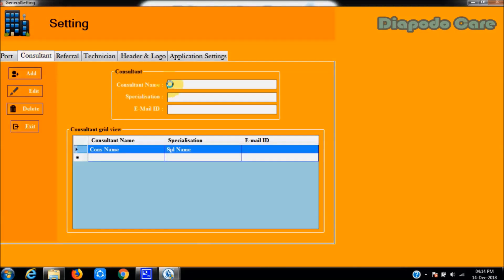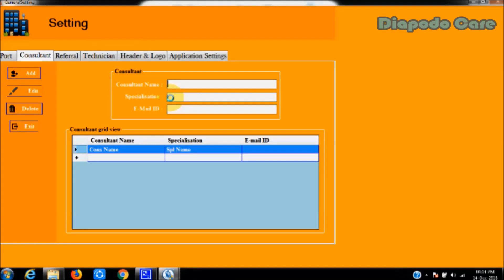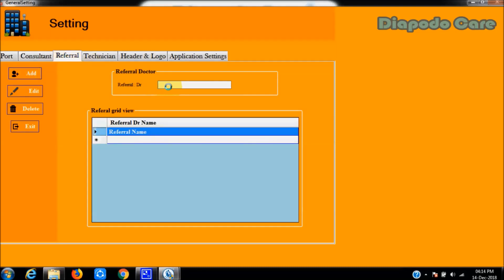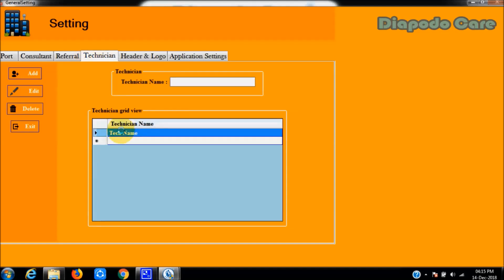In Vassabi software, users can store a list of consultants for easy usage. To save the consultant list, go to the consultant tab and add the consultant name, specialization, and email. Multiple consultants can be saved. Likewise, users can store multiple referral doctors and technicians. In this video, a sample referral doctor and technician are being added to demonstrate data entry.